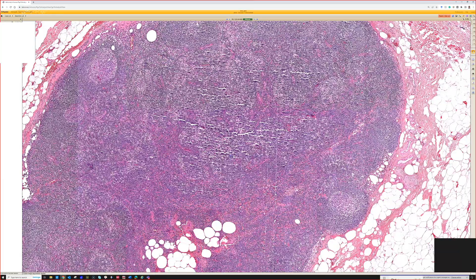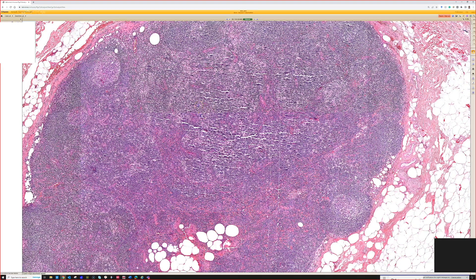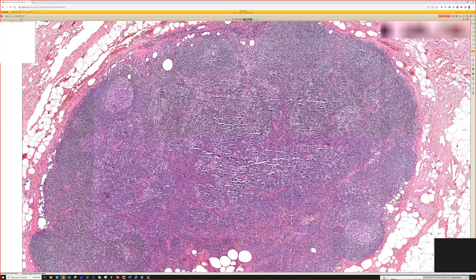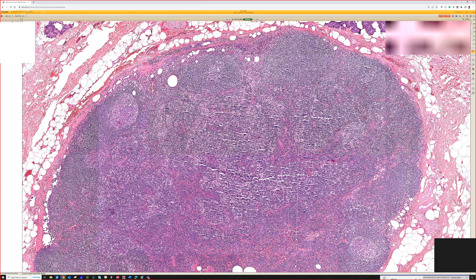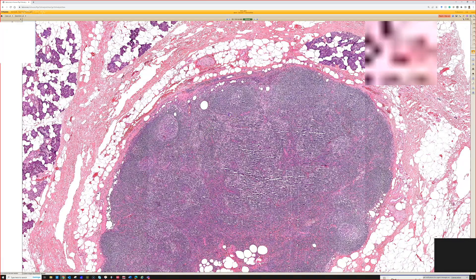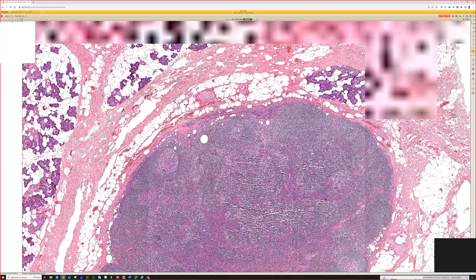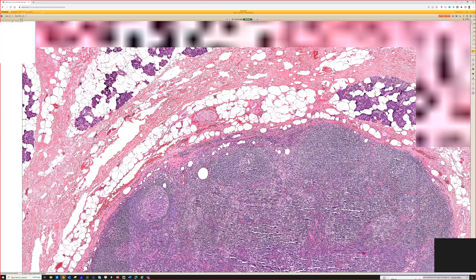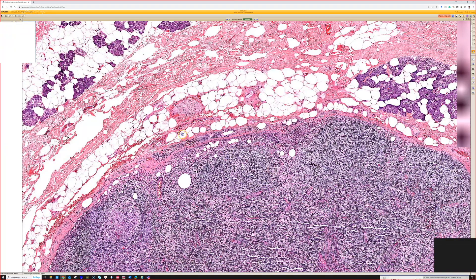Here's a lymph node. This was removed as a sentinel node for head and neck melanomas. Often when they do the radioactive tracer, the draining is often to a parotid node - if the melanoma is from, say, the temple or the ear. So I often see nodes in the parotid taken out, and then they take a partial parotidectomy with it a lot of times.